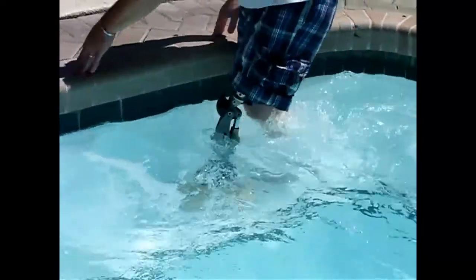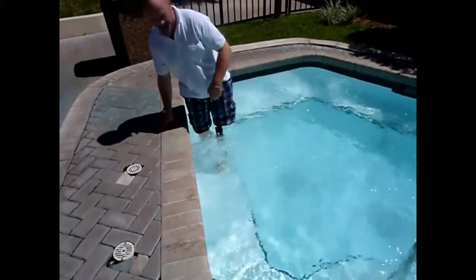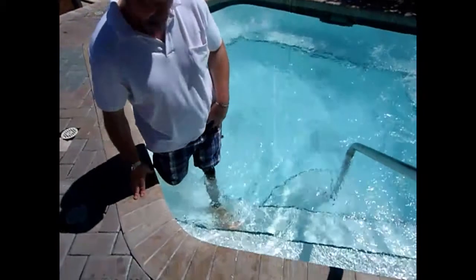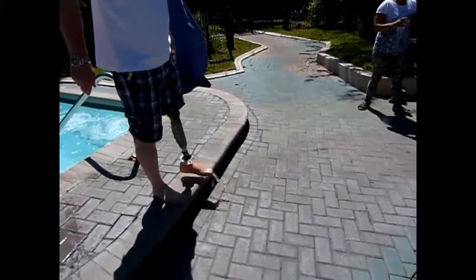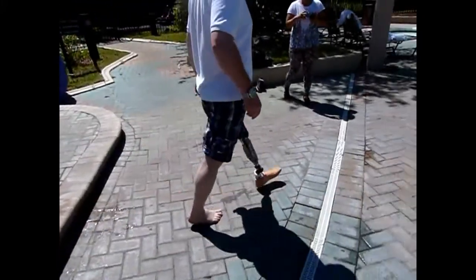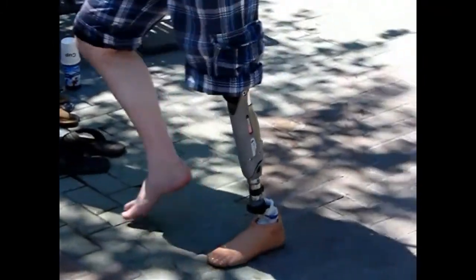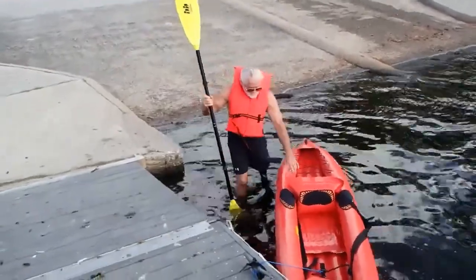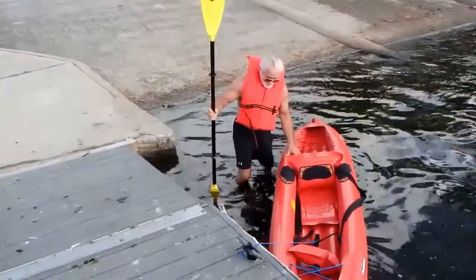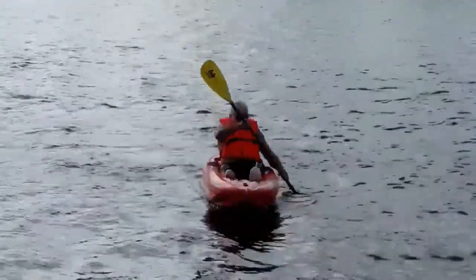There's a rule here, though, for all hydraulics: right about at 2 meters, the hydraulic seals are not strong enough to fight against water pressure, and the water pressure will invade the hydraulics and ruin them. So I have a general rule: don't go any deeper than waist deep. If you don't go any deeper than waist or chest deep, your knee is not going to be any more than 3 feet down. That's what we're saying: 3 feet or 1 meter is the maximum depth for the knee. So you can take it in the pool, play with your kids, play with your dog, not a problem. Wash it thoroughly afterwards.